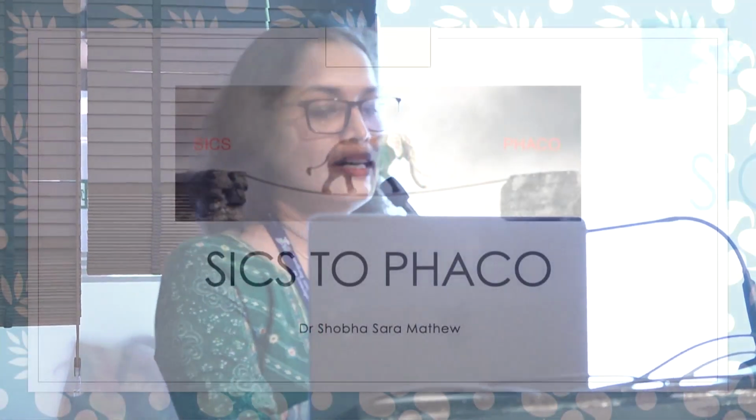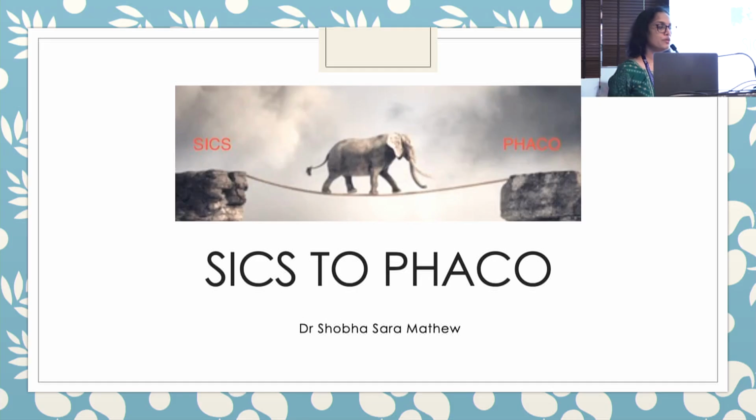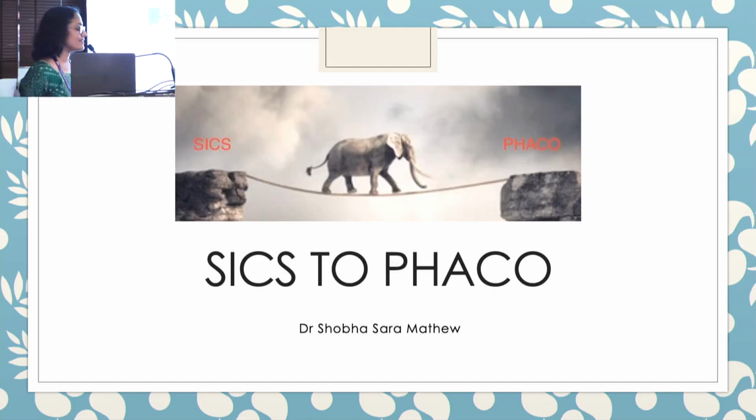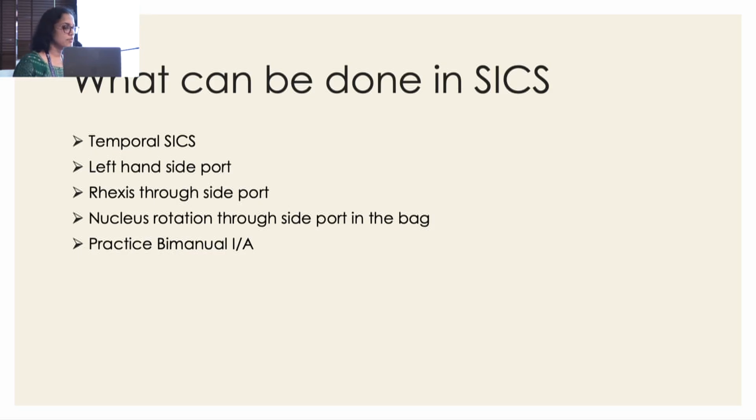So my talk will be on how a SICS surgeon can transform into a phaco surgeon. So as I told you, suturing is the life jacket, and SICS is the lifeline actually. So if you are a good SICS surgeon, becoming a phaco surgeon is not that difficult. So, if you're doing SICS, what all things can you do if you're thinking in future I have to do phaco? One thing is temporal SICS.